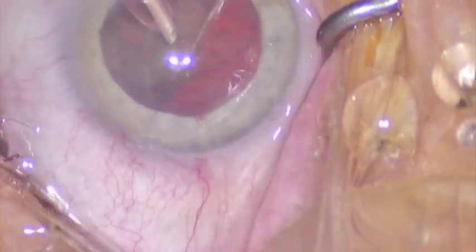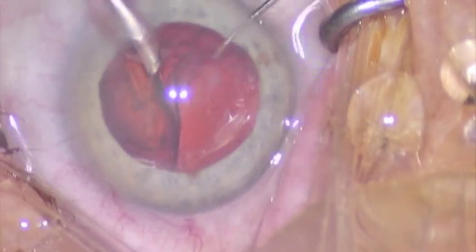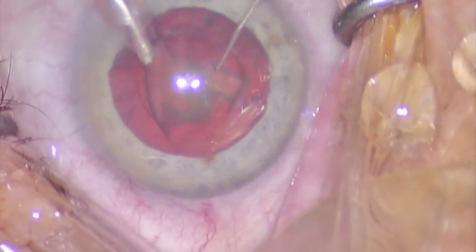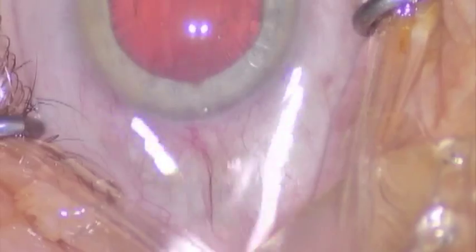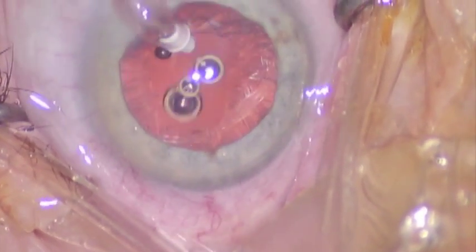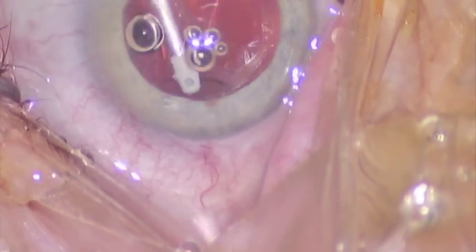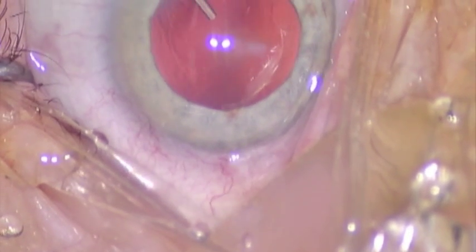So we use a second instrument to help flip our piece and our lens pieces. So again, this is a no-rotation — except for removing the quadrants, of course — technique where we achieve a plus, as in a divide-and-conquer method, without actually having to rotate the lens for each quadrant's individual attention. And then we simply proceed from there. This will reduce your CDE or dissipated energy, as well as your phaco time, significantly, and it involves less manipulation of the eye.